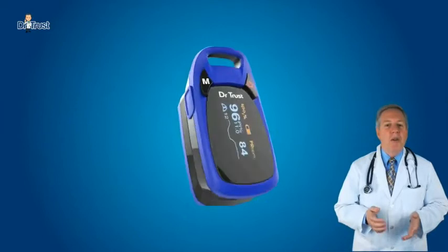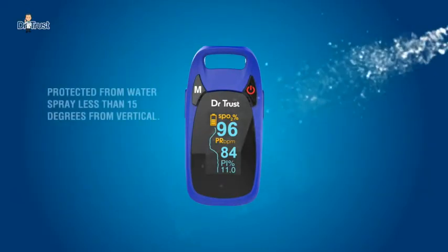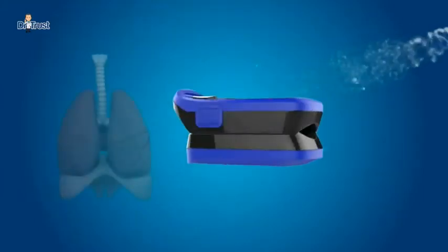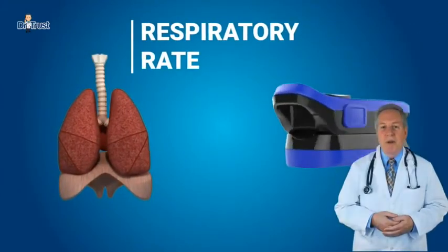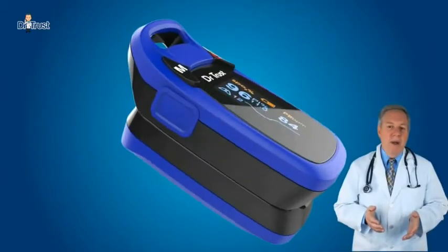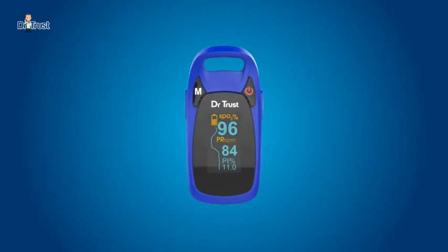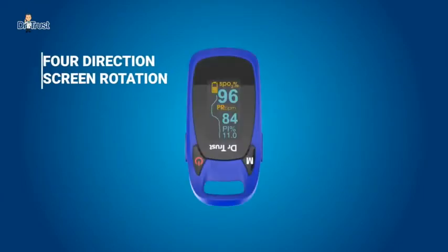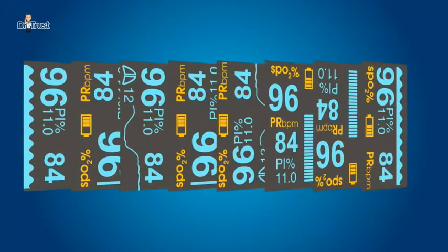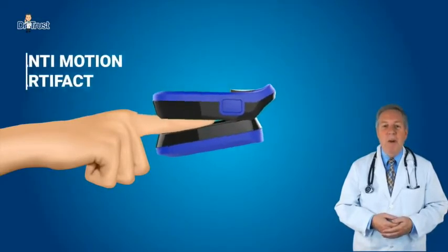The Professional Series Pulse Oximeter is water resistant. The product has an advanced DSP algorithm that can diminish the influence of motion artifact and improve measurement accuracy of low perfusion.